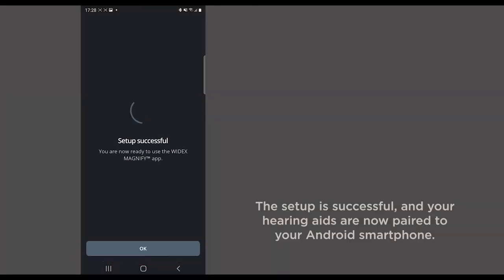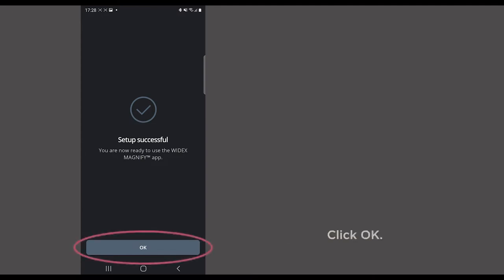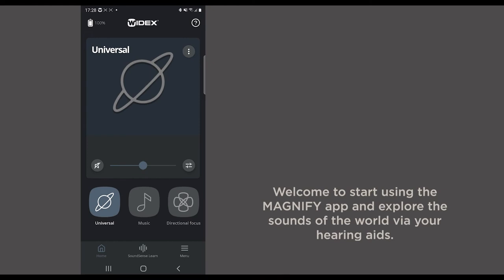The setup is successful and your hearing aids are now paired to your Android smartphone. Click OK. And welcome to start using the Magnify app and explore the sounds of the world via your hearing aids.